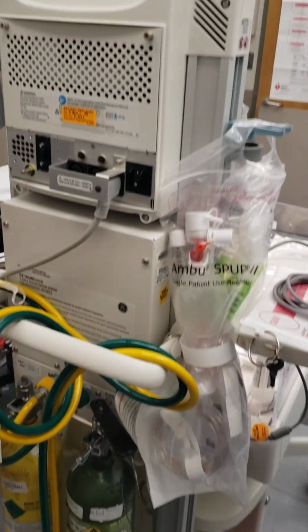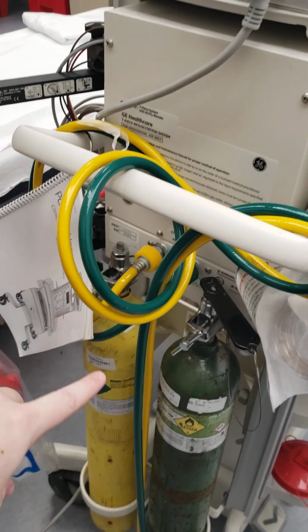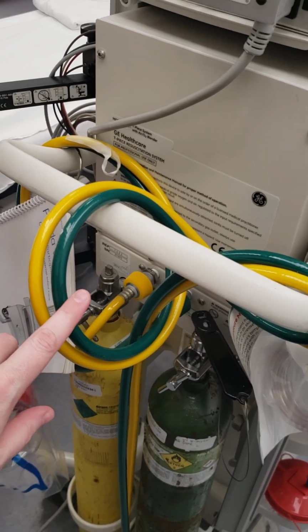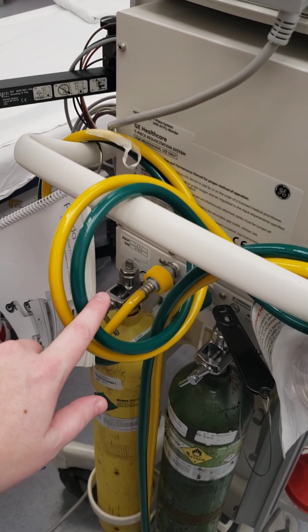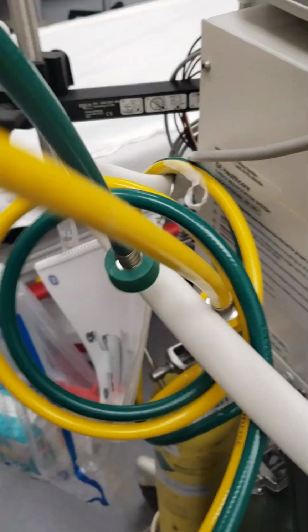So in this video on getting our Panda Warmers all set up, I'm going to show you how to hook up these here. This is so that we can use wall, medical air, and oxygen if we need to in order to provide the right amount of breaths and oxygen percentage for our kids.